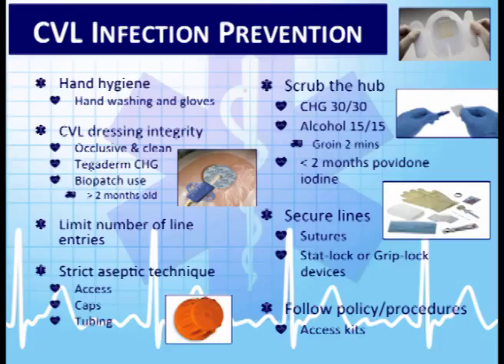And practices are always changing. This is what our facility, most facilities here in Waukesha County, do, it may change, but the more evidence-based information they get, they update the policies, and this is the caps probably, what would you say, Blake? I think probably the last 5 years we've had the alcohol caps on most facilities.